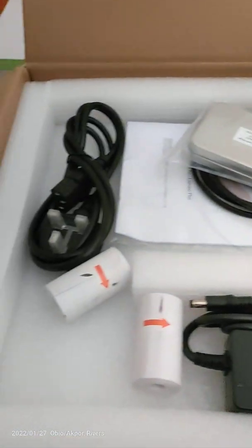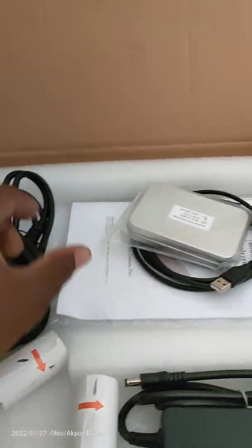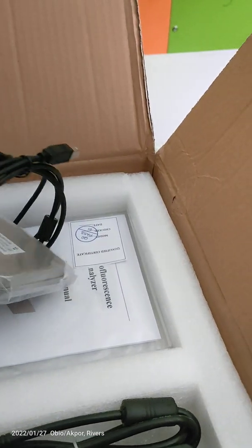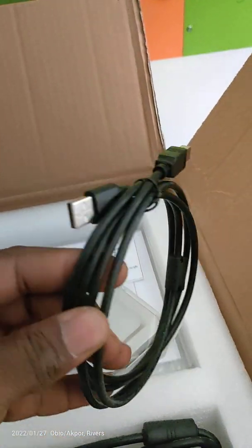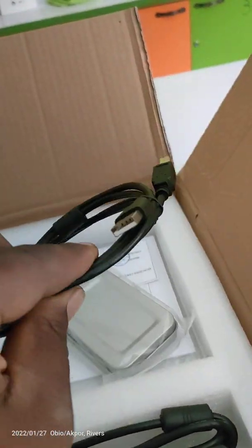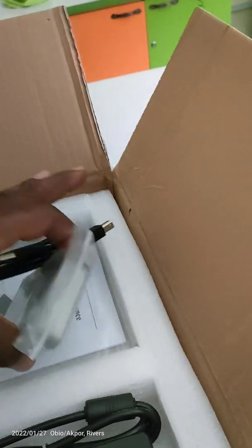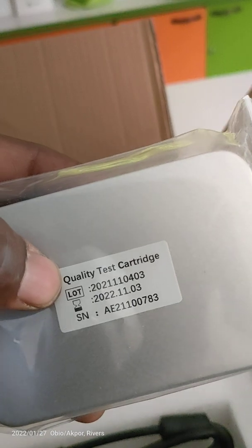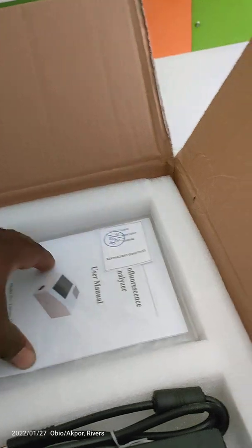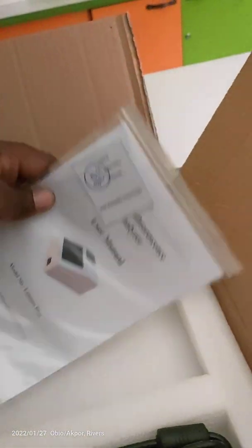Okay, first unpacking: this is the power cord, this is the power adapter, this is a connecting wire to the printer. If you want to use an external printer you can use this to connect to it. This is the QC card, the QC test cartridge, and this is the user manual. Try to read this — the user manual.